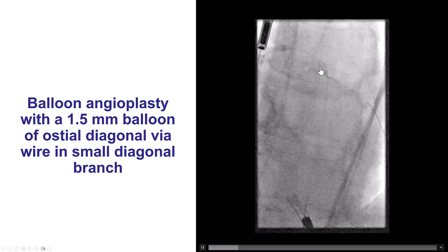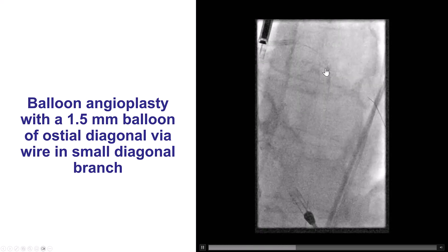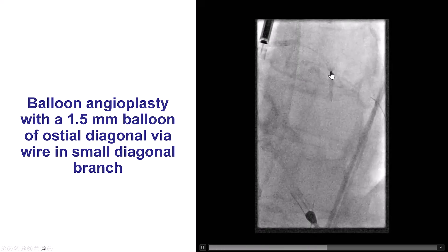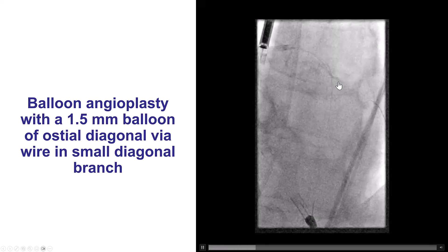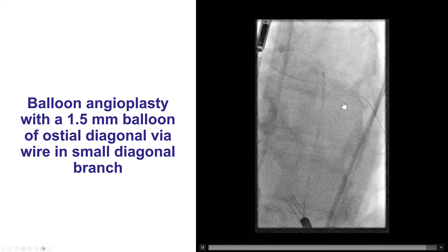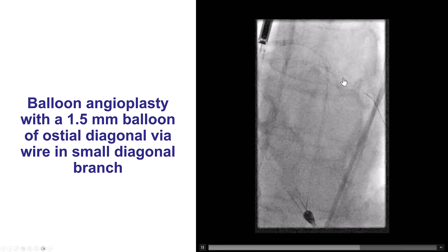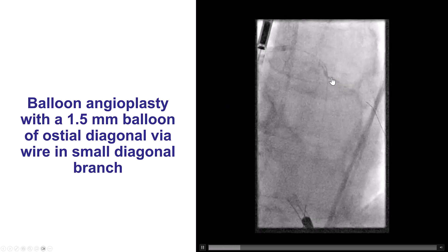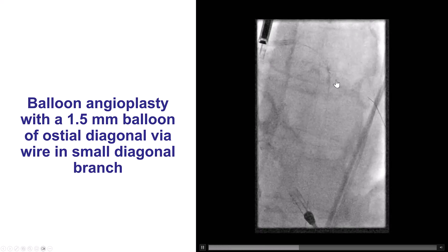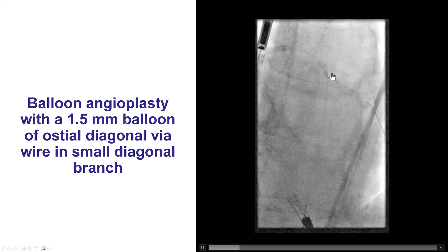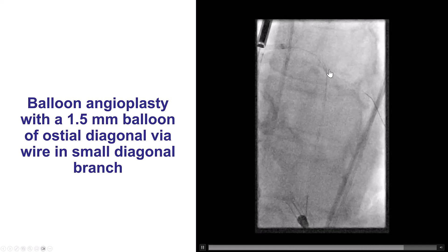Eventually, what we decided is to try to get a dual-lumen microcatheter over the existing guidewire into the superior branch and then use that dual-lumen as a means to advance another guidewire into that inferior branch of the diagonal. However, the Sasuke would not go into the diagonal because there was significant lesion at the ostium, so we did predilatation with a 1.5 mm balloon. What we are seeing here is an example of grenadoplasty, or balloon-assisted microdissection — essentially the balloon ruptured. Fortunately, it is a small 1.5 mm balloon, so no harm is done.